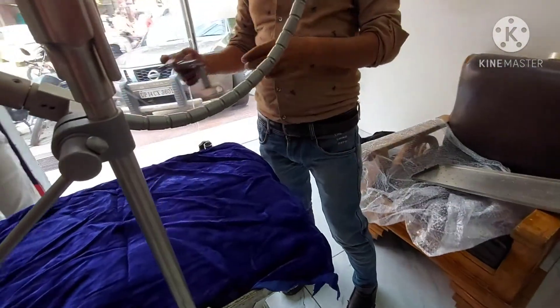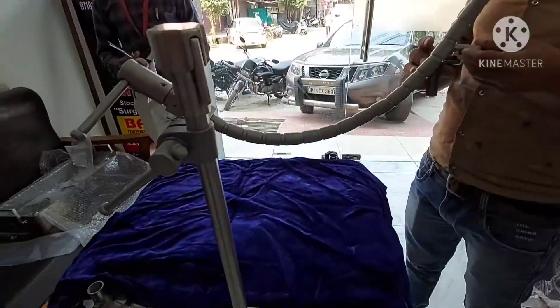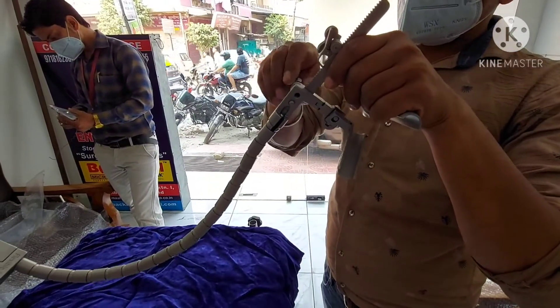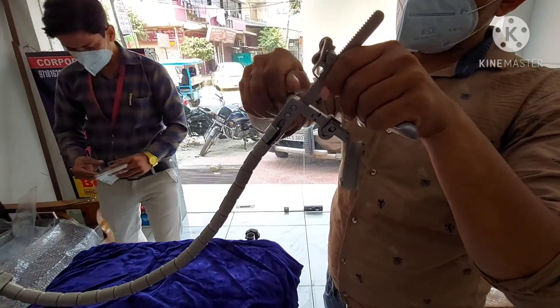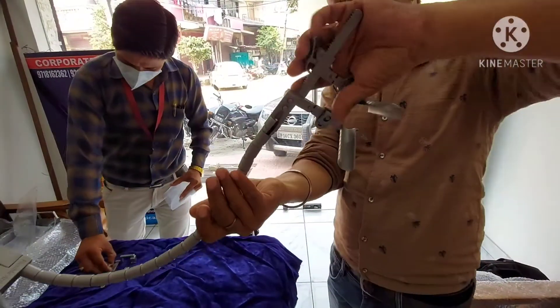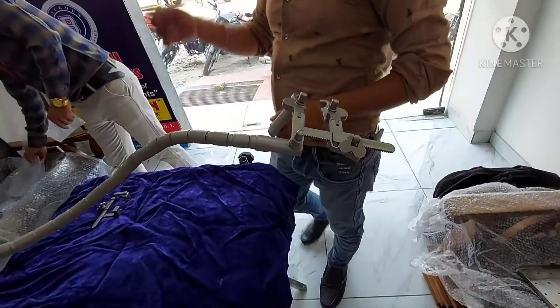Now you can see the expandable retractor is being attached to the flexible arm. This system also includes tubular retractors which are available in 3 sizes: 17.5 mm, 21.5 mm, and 24.5 mm.